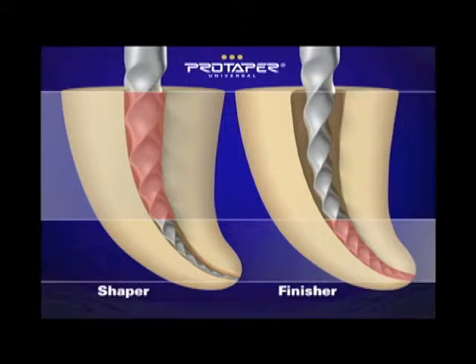We're cutting and shaping immediately in the upper two-thirds of the canal. The finishers have decreasing percentage tapers, because if you ran a fixed taper of 8% out over the active portion, you would have a giant sequoia — stiff and likely to blow out a lot of roots. By decreasing the percentage taper, two important things happen: we increase flexibility and we conserve precious lateral dentin. That's ProTaper.